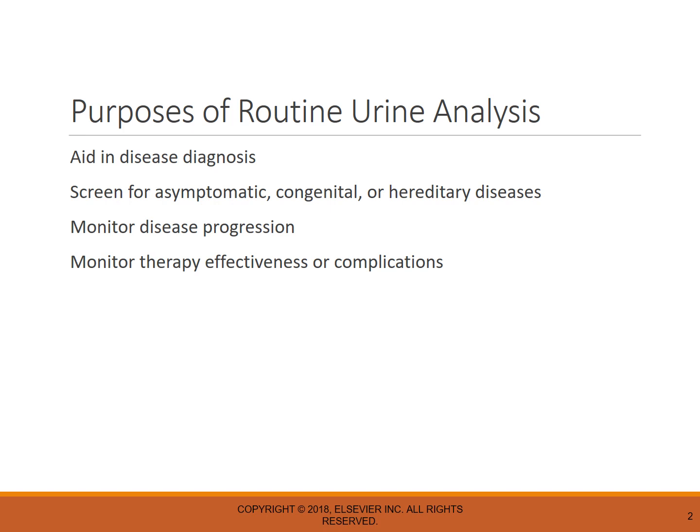So really, to obtain accurate urinalysis results, the integrity must be maintained. If a urine specimen is submitted for testing that's inappropriate, or if the composition has changed due to improper storage or handling, testing will produce results that don't reflect the patient's condition. So in such situations, even the highest quality reagents, equipment, and expertise cannot identify anything unacceptable about the patient sample.